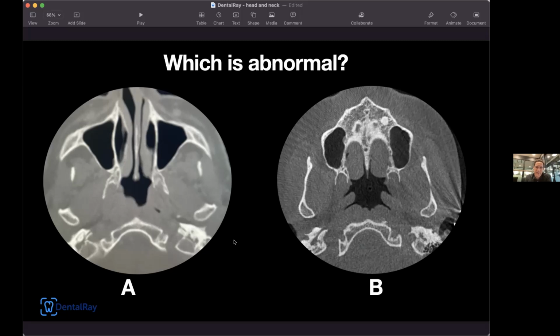Okay, nice job. So again, this is a what is where it shouldn't be, or what is missing from this image. And for a radiologist and anybody looking at a CT scan, a symmetric appearance of the CT scan is definitely your friend. So we're going to look at the normal. This is normal from a cone beam CT, and then this is very abnormal. So we're at the level of the maxilla. You can see the hard palate and the maxillary sinuses, and you can see this is the nasopharynx. So this is a very characteristic and normal appearance.